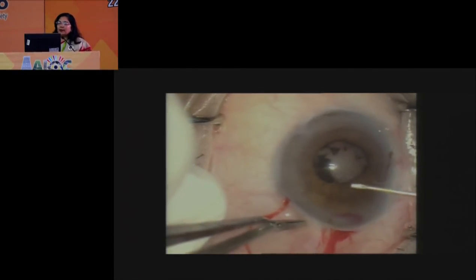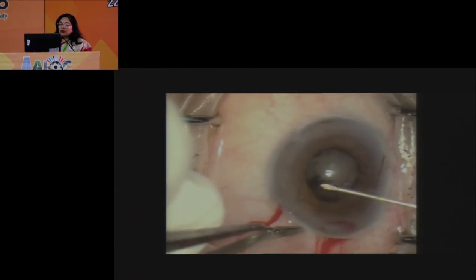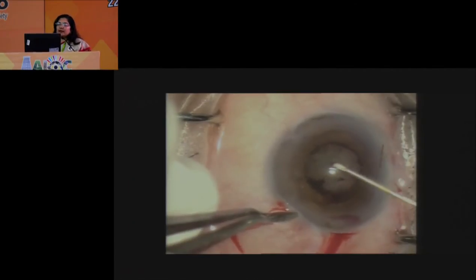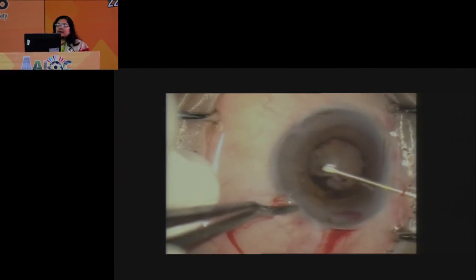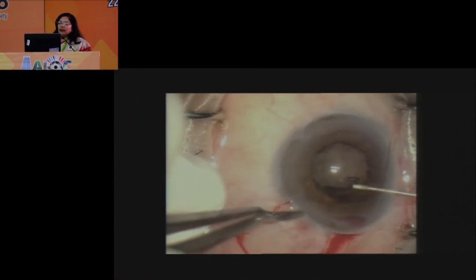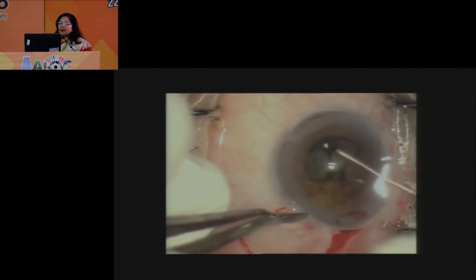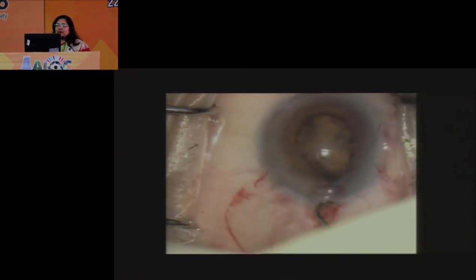So in a patient of a complicated cataract who already has synechiae, again the use of a capsulotomy needle to gently open up the pupil. So the pupil now is a little more dilated than it was when we started. A capsulotomy within this dilated pupil will be less in diameter than what you normally would do, but it is important to be safe, because if it is under the pupil, again you do not know what you are doing. So this is all pigment which has dispersed during the capsulotomy, which will anyway be removed.